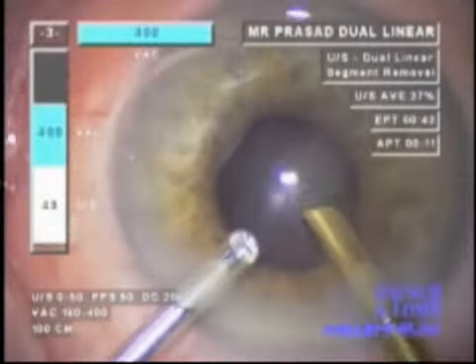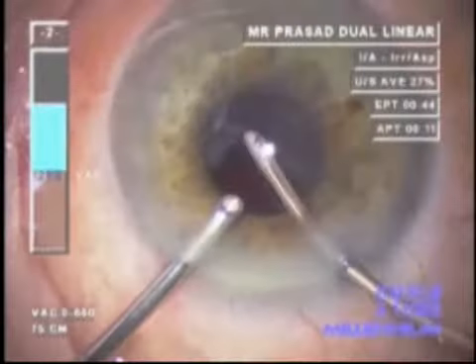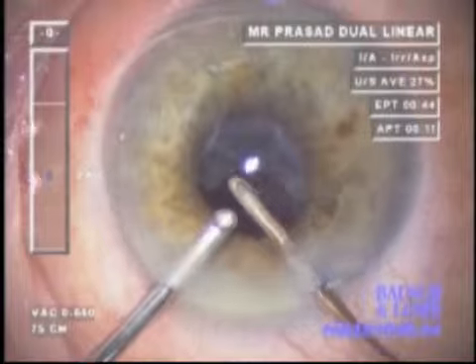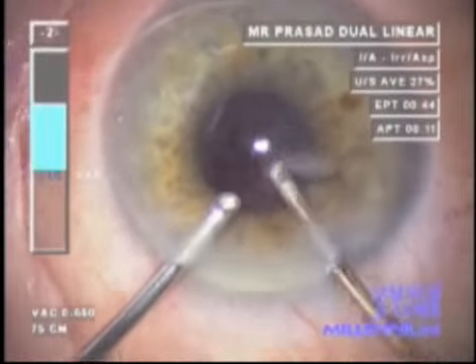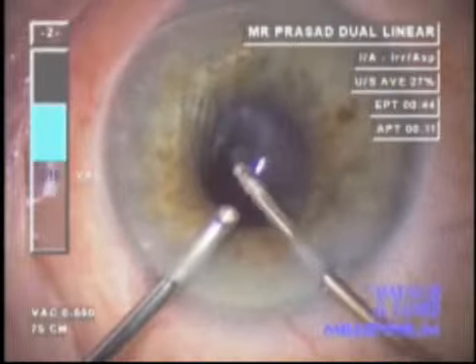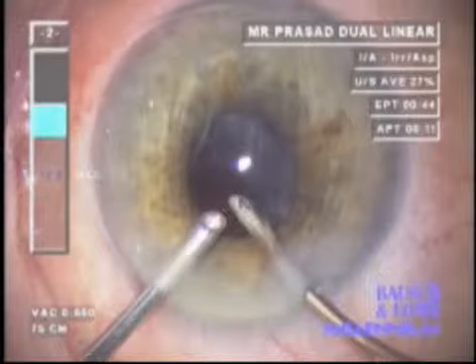As the last bits of nucleus are removed, the irrigating chopper moves out of the iris plane to avoid the risk of damage to the capsule should the anterior chamber collapse. Although that is rare with modern fluidics, irrigation-aspiration using a biaxial technique is then performed.